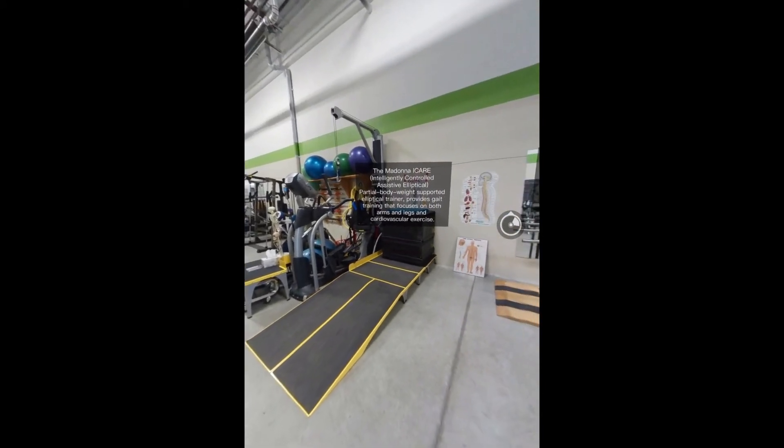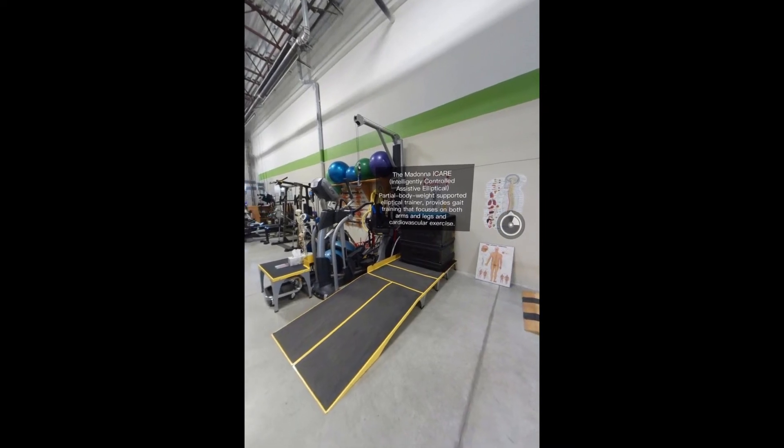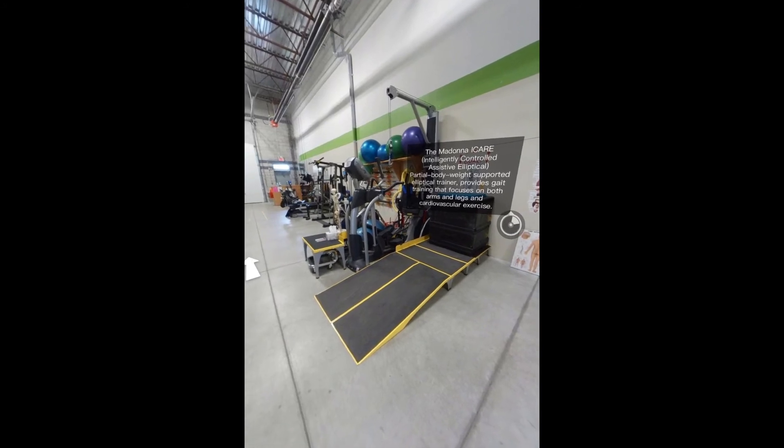The Madonna ICARE is a partial body weight supported elliptical trainer. It provides gait training that focuses on both arms and legs and also provides cardiovascular exercise.